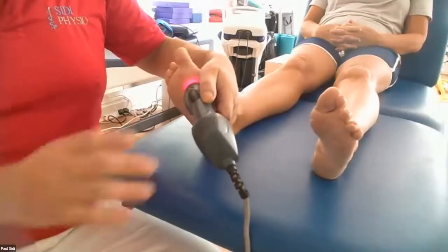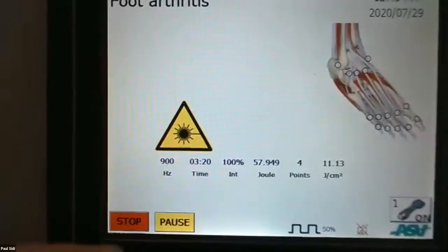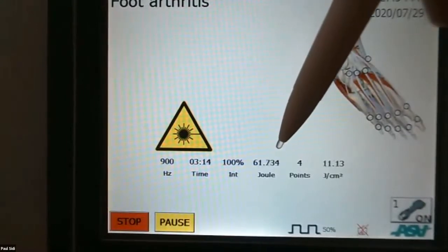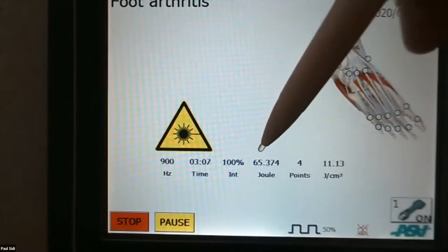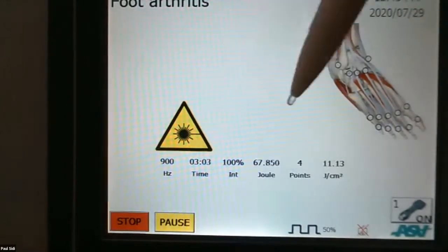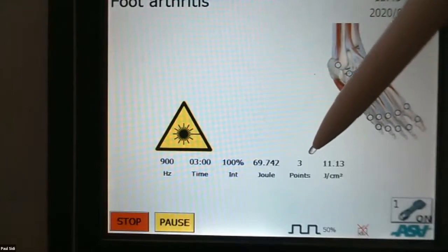Now I'm going to keep it going, and I'm going to go back to the screen. I'm going to show you what's happening on the screen. Right. You can probably see what's happening is the joules are adding up. Okay, we're at 11.13 joules per square centimetre. That's not going to change because we're keeping it steady. But the total joules are adding up. The time is going down, and we started with 5 points. We've already done 1 point, and now we've done the second point.